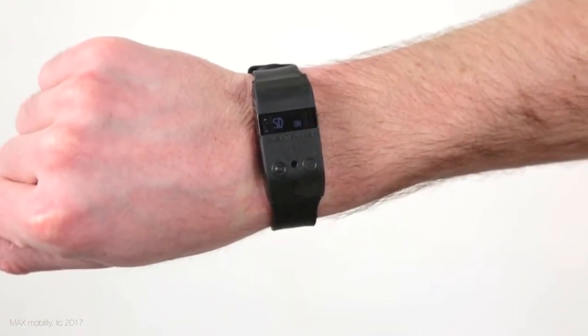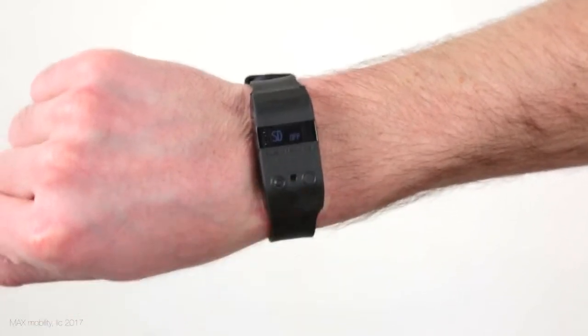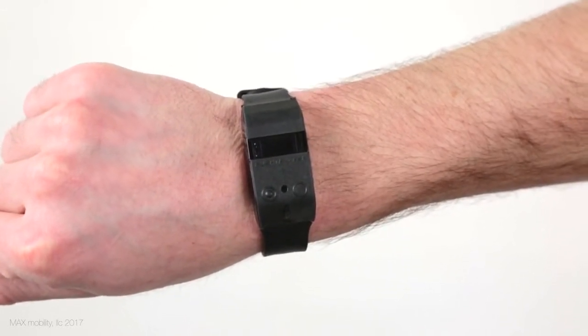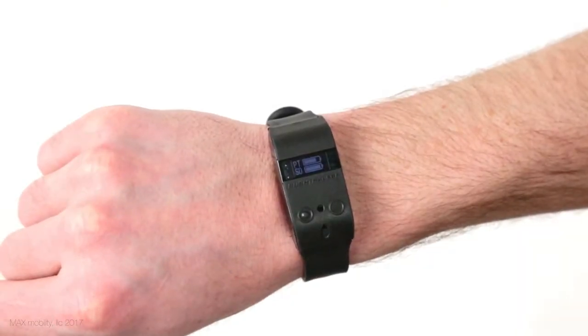The PushTracker's embedded lithium-ion battery is designed to last for an entire day of smart drive use and also propulsion activity monitoring when pushing around without the power assist. You'll also want to put your PushTracker in sleep mode by holding the left power assist button for 3 seconds anytime you aren't wearing it to conserve the battery and help prevent false push counts when it's in your bag. Otherwise, the accelerometer still draws some current trying to count your pushes, which unnecessarily drains the battery.